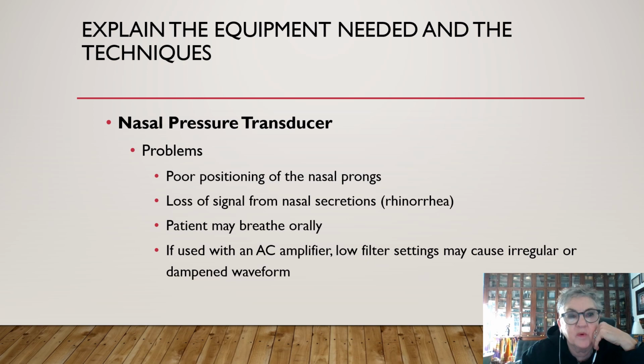Problems can occur with the nasal pressure transducer. They include poor positioning of the nasal prongs and loss of signal from nasal secretions. The patient may breathe orally. If used with an AC amplifier, low filter settings may cause an irregular or dampened waveform.